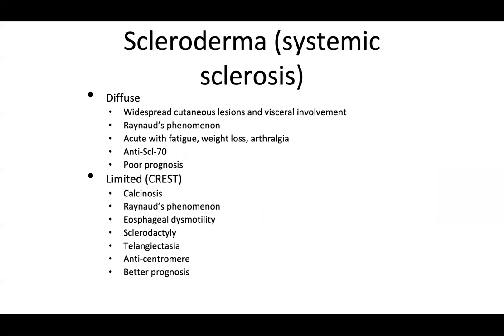Scleroderma or systemic sclerosis, it's difficult to tell on biopsy morphea versus scleroderma, especially if you're biopsying a burned out sclerotic dermis. So keep that in mind that many times these are practically signed out as sclerosing dermatitis, consistent with morphea or systemic sclerosis or localized scleroderma, depending on what clinically you think is going on. Clinical correlation will be essential to be able to make that diagnosis.